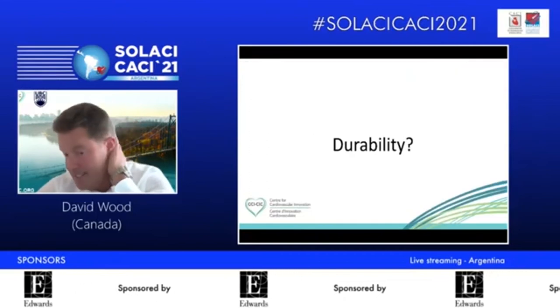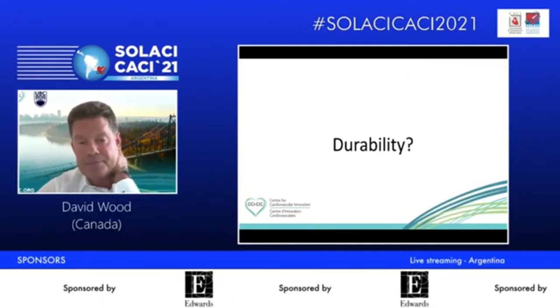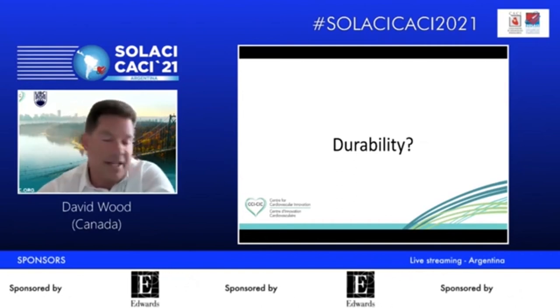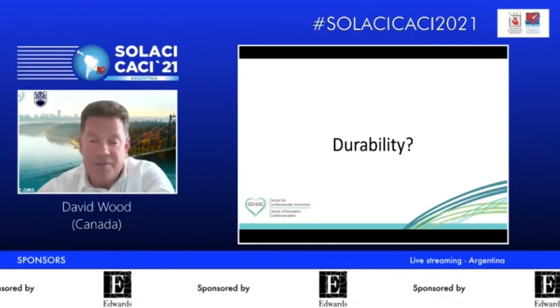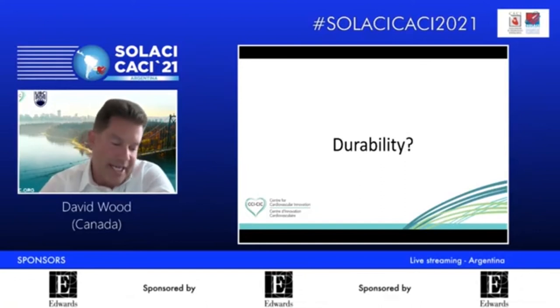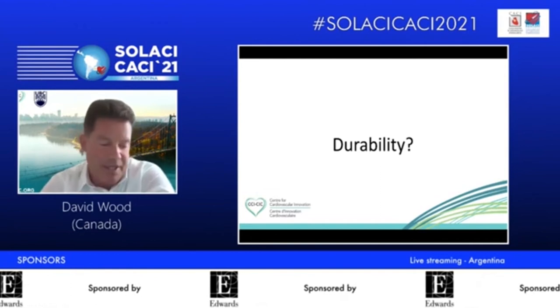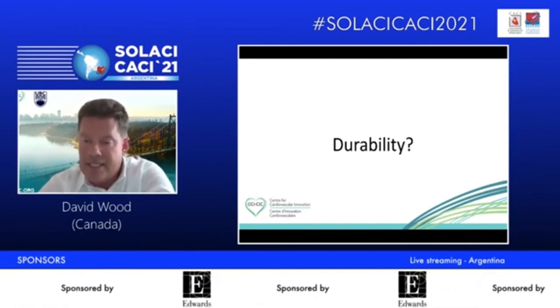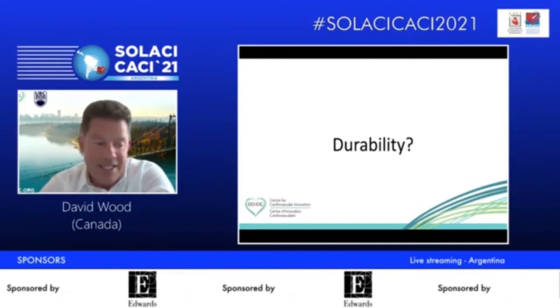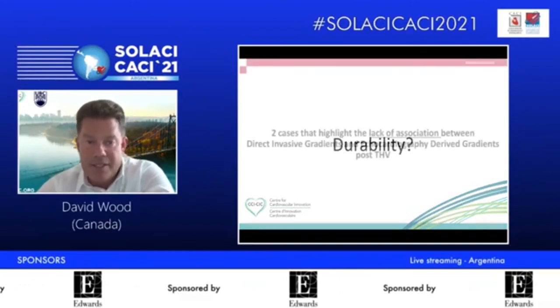Now durability, and this has become a passion for John and me since, I guess, early last year, Philippe, when we connected with Amr and yourself and realized that this data is not new. Philippe and others and Amr have been working on this for many, many years, but it became very real to John and me when we saw people treating or not treating valves based on echo-derived gradients. They'd see a gradient of 32 and bring the patient back for a redilatation in late follow-up or do a redo TAVR. And it just didn't make sense when it seemed like these valves otherwise were working appropriately.